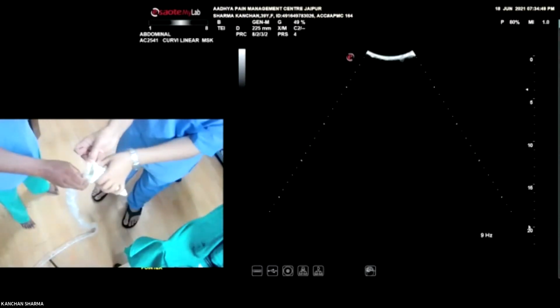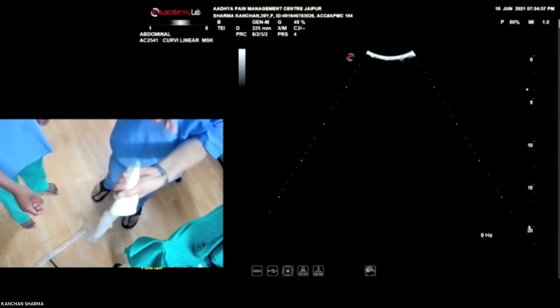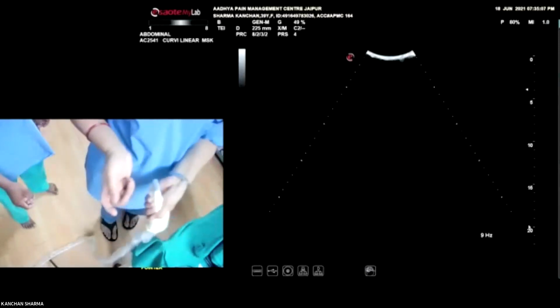And then we will be holding it from here. Okay, and then you can tighten it like this with a gauze piece. Now you can use betadine as your medium; in fact, you have the jelly also inside the glove, and now you can dip it in betadine and just use this probe, and this is equally going to be sterile.